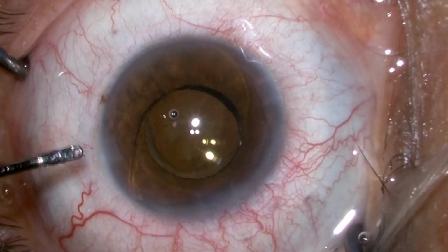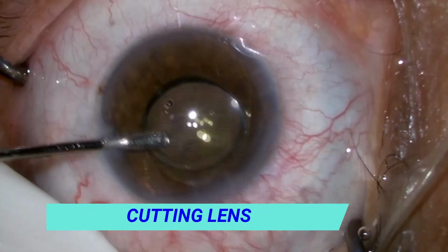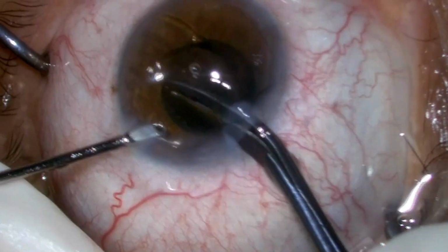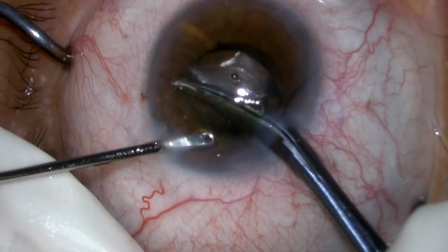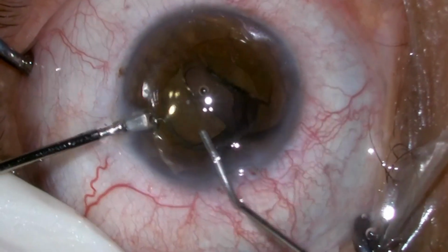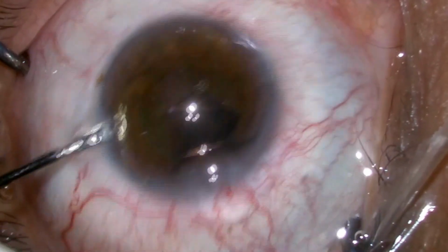Now once the lens is out in the anterior chamber, we will cut this lens into two parts with the help of these Vannas scissors. Now we have cut the lens into two parts, and we will take them out one by one.